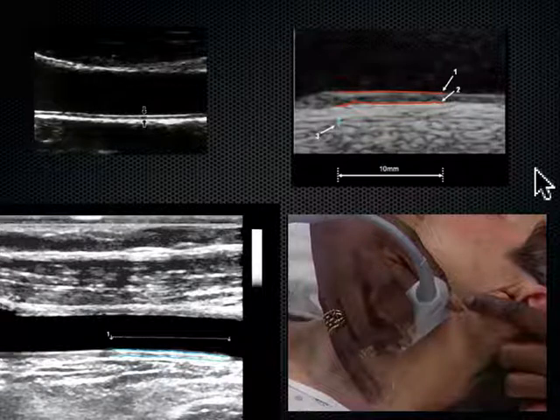CIMT. Any questions before we change gears one final time? Just something to introduce you to. And when we look today on the models, it's just a linear echo. You can't even see a separation because everybody's so young and healthy, okay? But when you take this machine with you out to preceptorships or clinics, wards on older patients, you will start to see these thicknesses come off the screen.